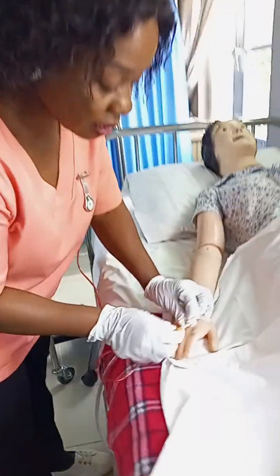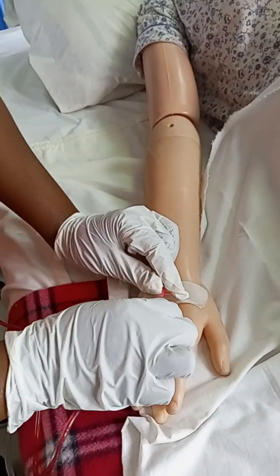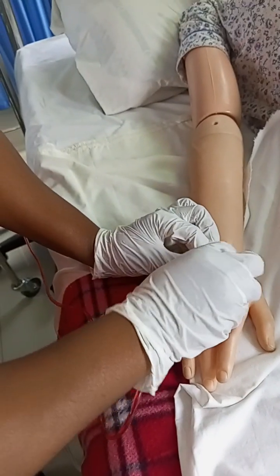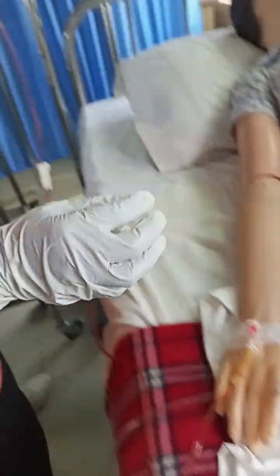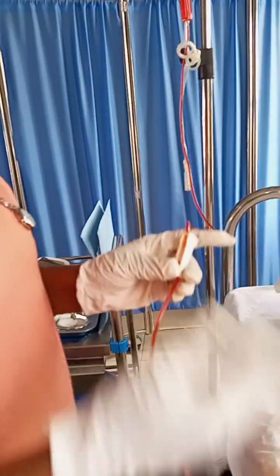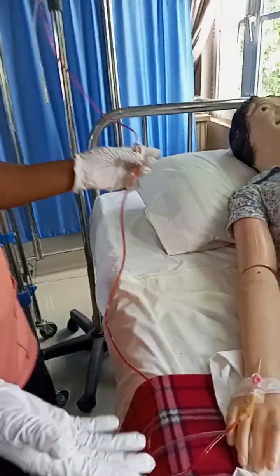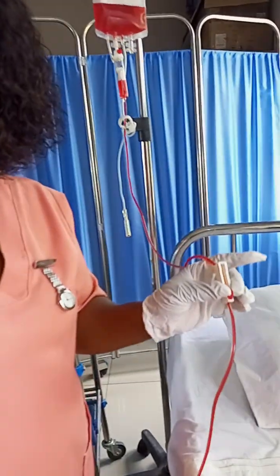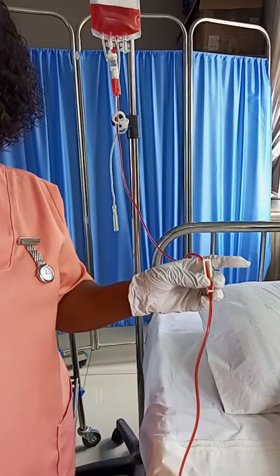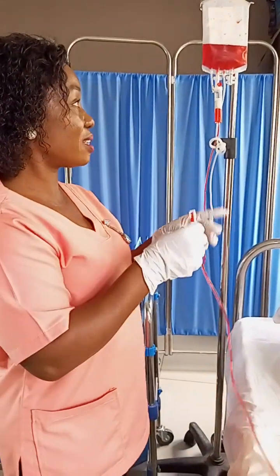I connect to the cannula, which is connected to the patient's body. So I close, and I regulate. Remember, this is a dummy patient. Of course, if I open it, it will just stain the bed. So now I open and regulate the drops, maybe 10 drops per minute or 15 drops per minute. As you can see, I regulate, so the blood is going.